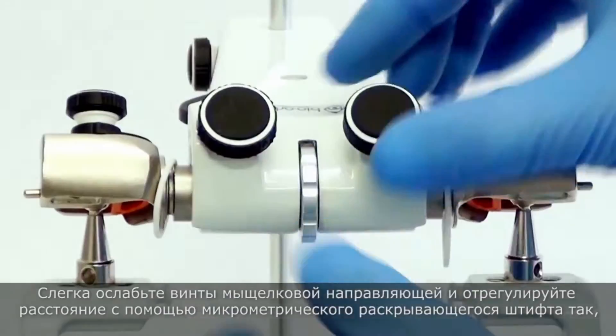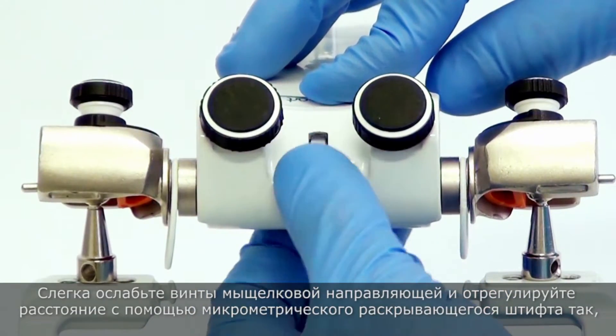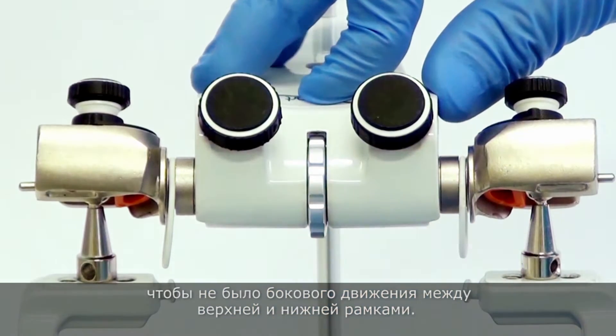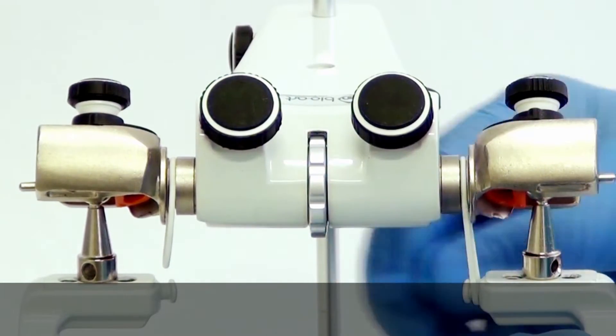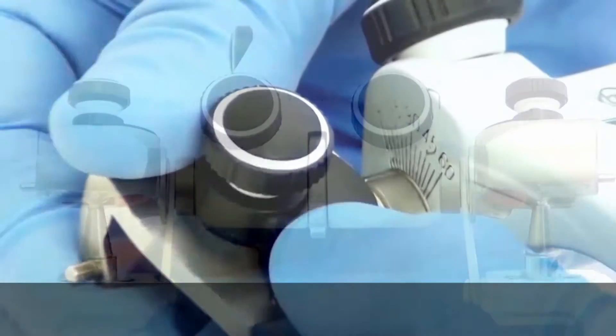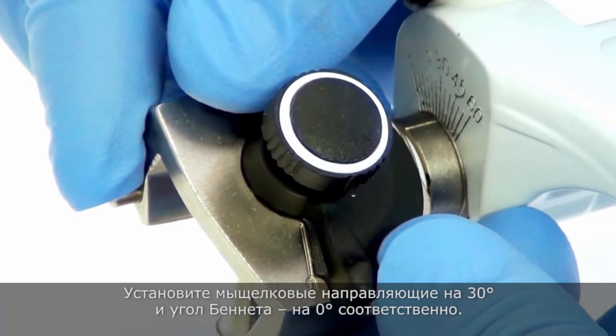Slightly loosen the screws of the condylar guide and adjust the distance through the micrometric expander spindle so that there is no side movement between the upper and lower frames. Place the condylar guides at 30 degrees and the Bennett at 0.